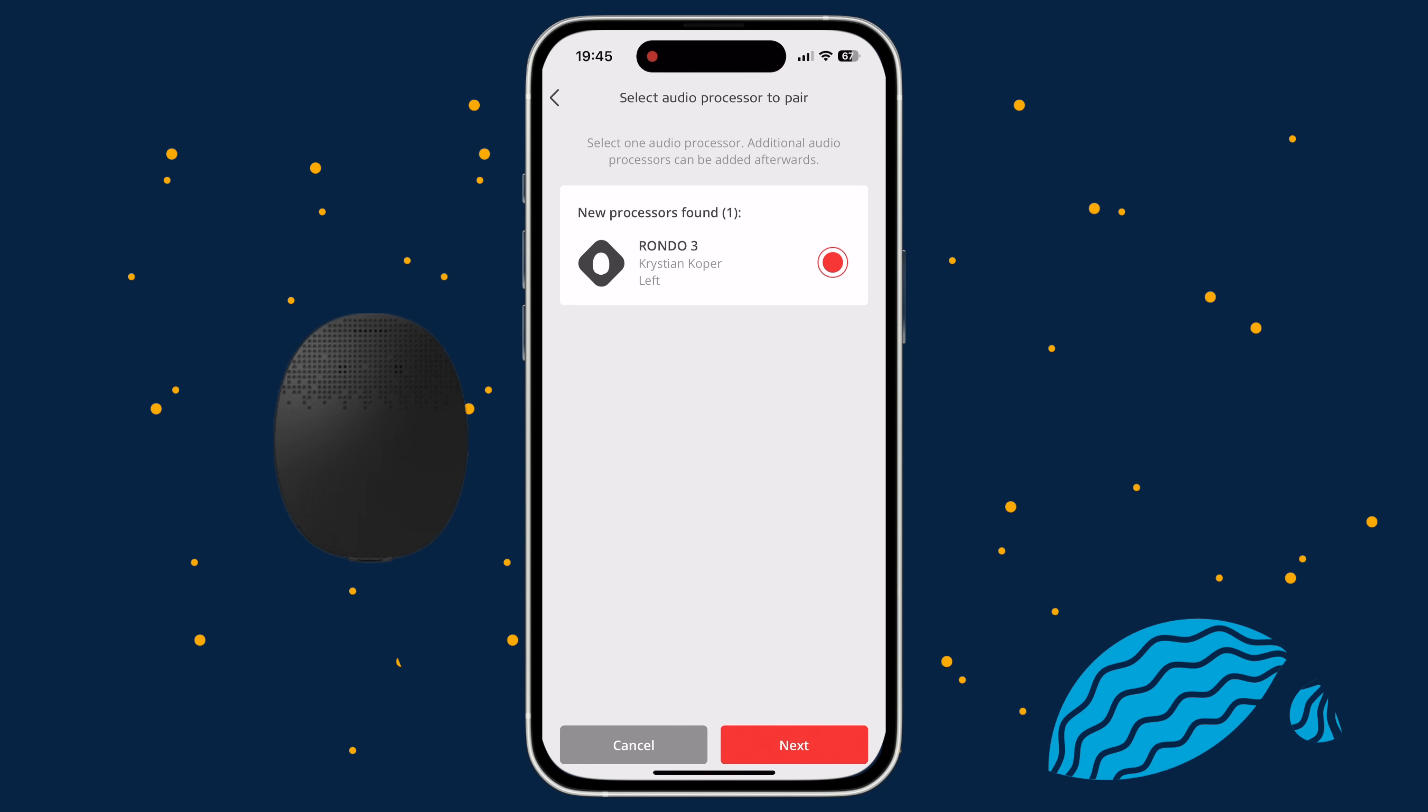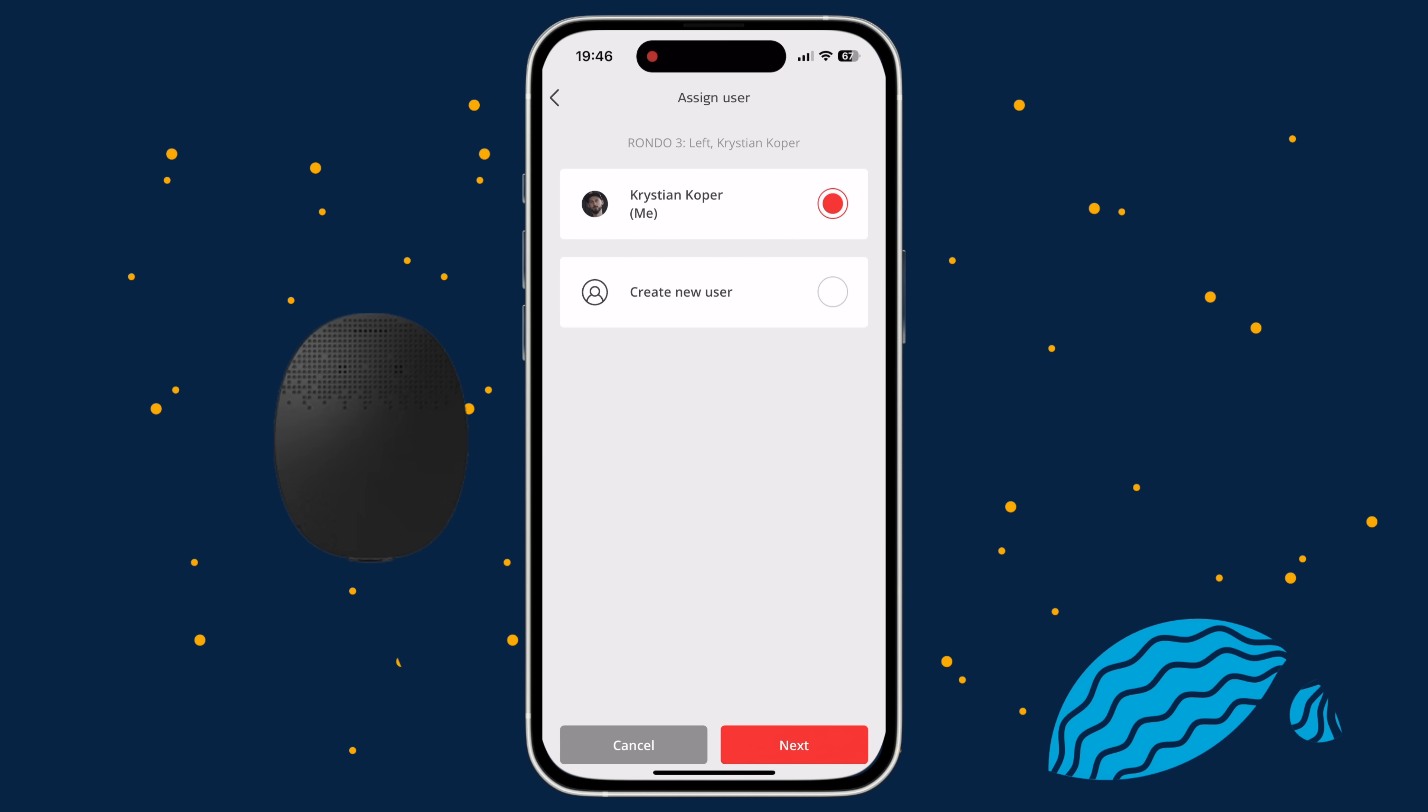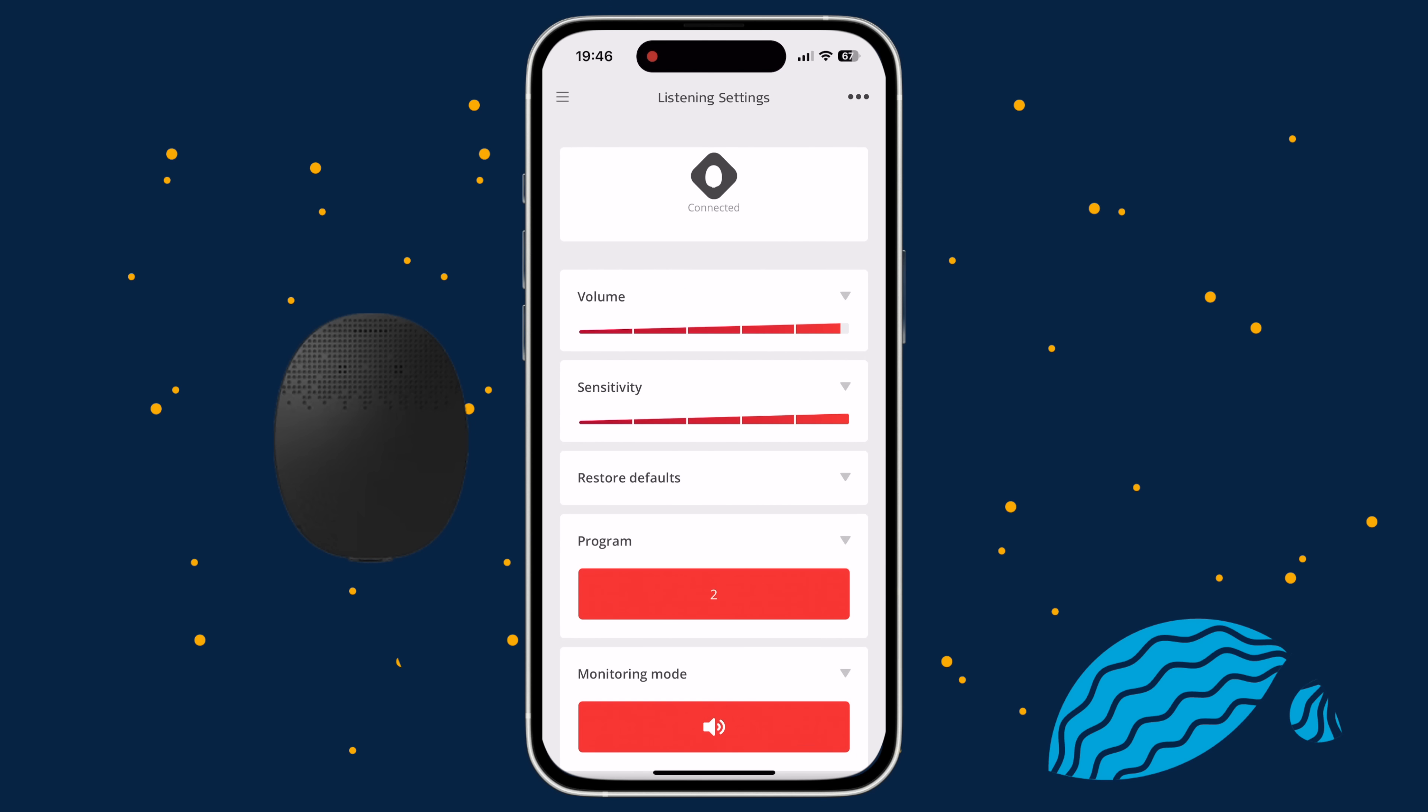Assign a user to the Audio Processor. If it's your Audio Processor, select your own account and tap Next. If the Audio Processor belongs to your child, or someone you look after, then select the corresponding user from the list. Tap Create New User, then Next, enter their name and tap Create. Your Audio Processor is now paired with Audio Key 2.